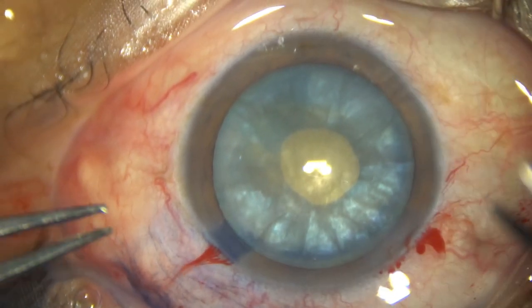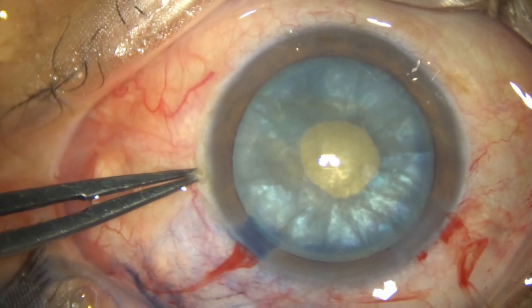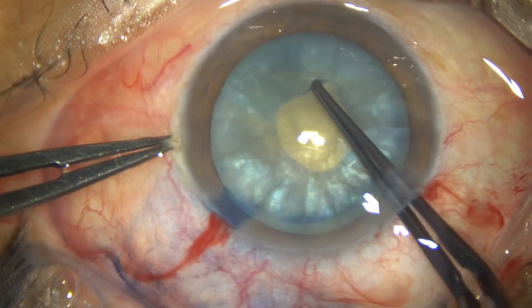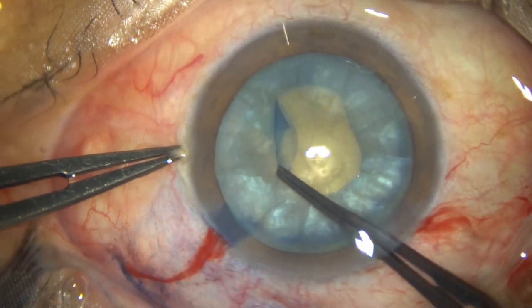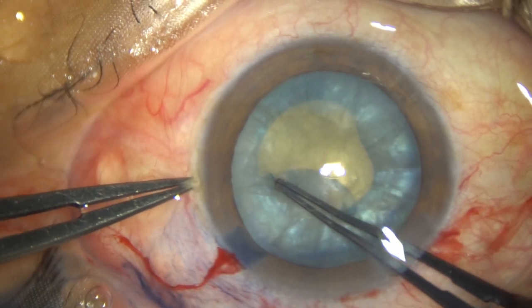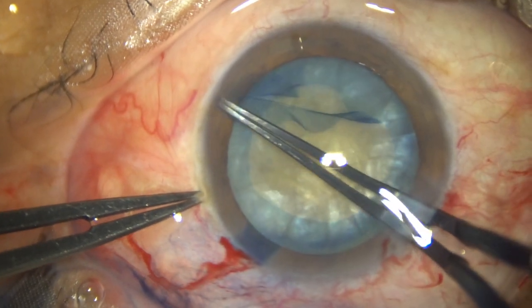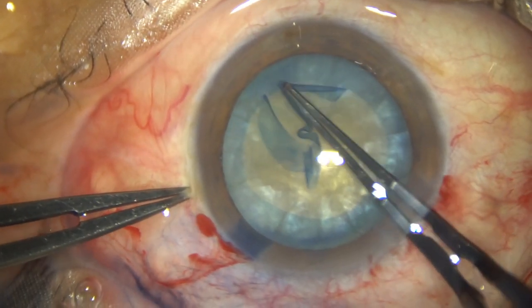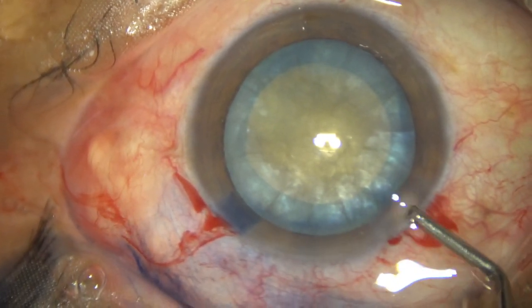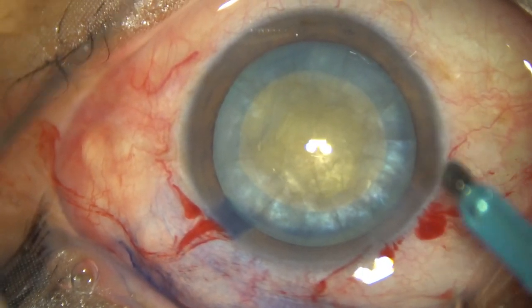The Utrata forceps is taken again, and this small rhexis is converted into an optimum-sized rhexis of about 5.5 mm, and it has been nicely done. So, the most difficult part of intumescent cataract — that is the rhexis — has been done nicely.